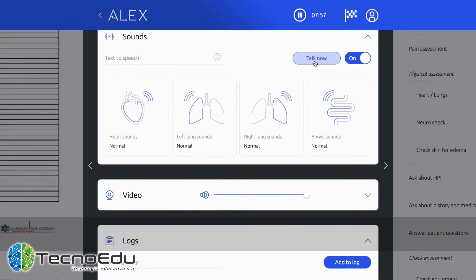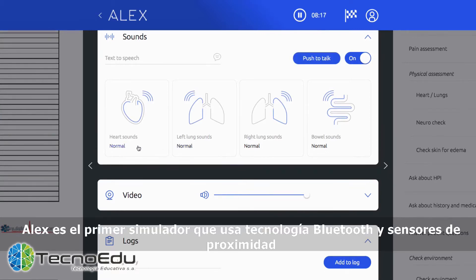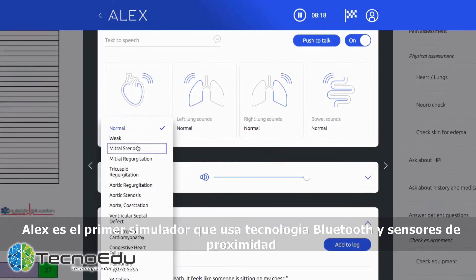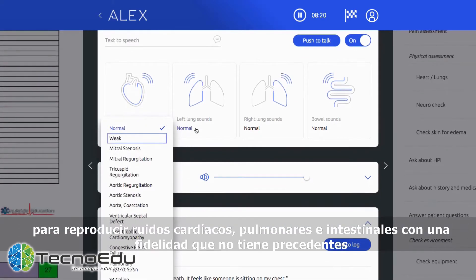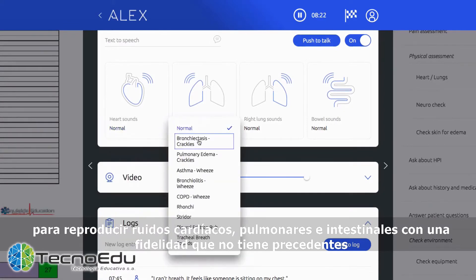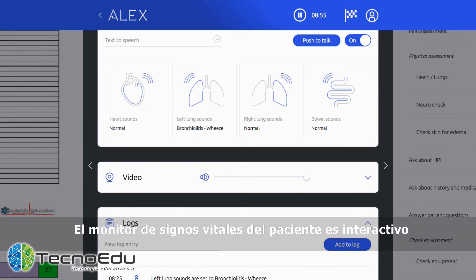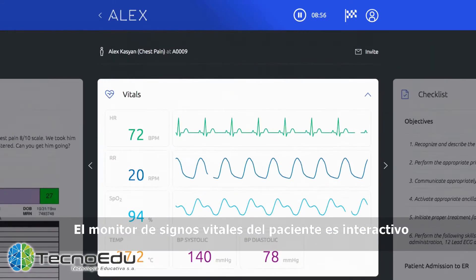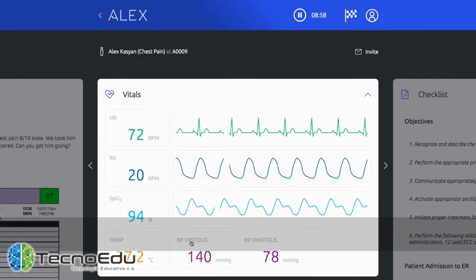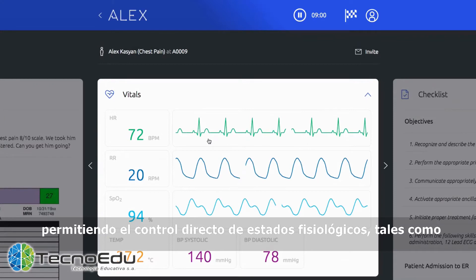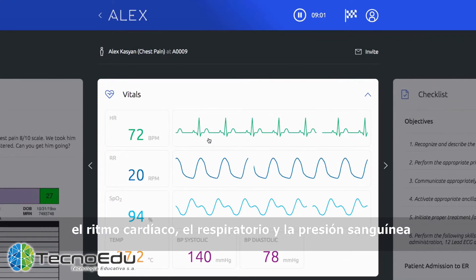Alex is the first simulator to use Bluetooth technology and proximity sensors to provide heart, lung, and bowel sounds in unprecedented fidelity. The virtual patient monitor is interactive, enabling direct control of physiological state like heart rate, respiratory rate, and blood pressure.